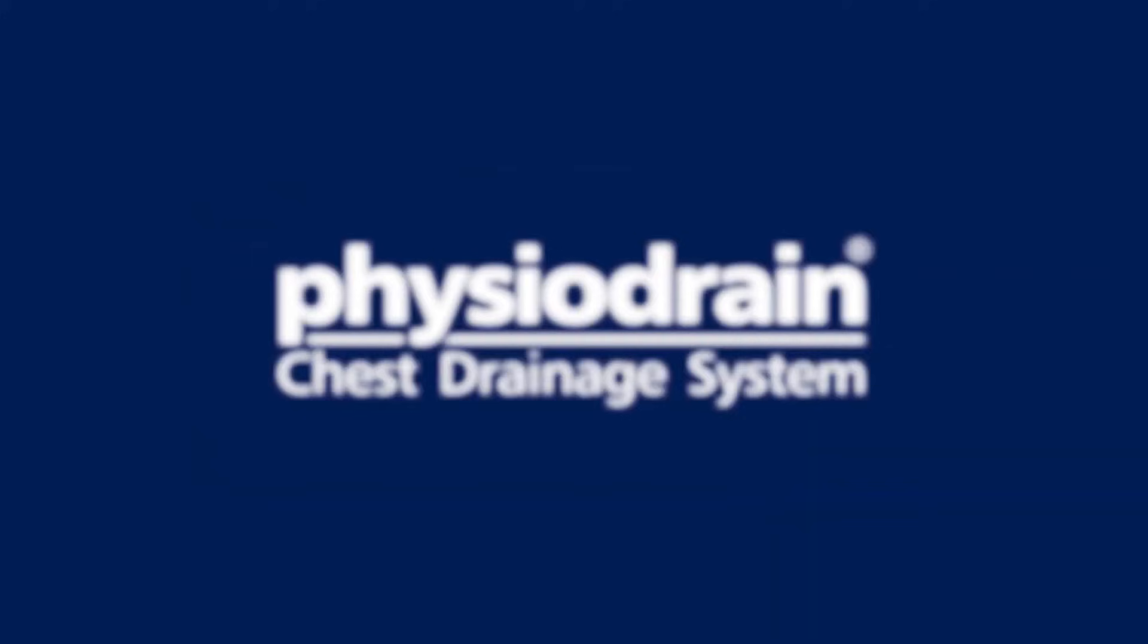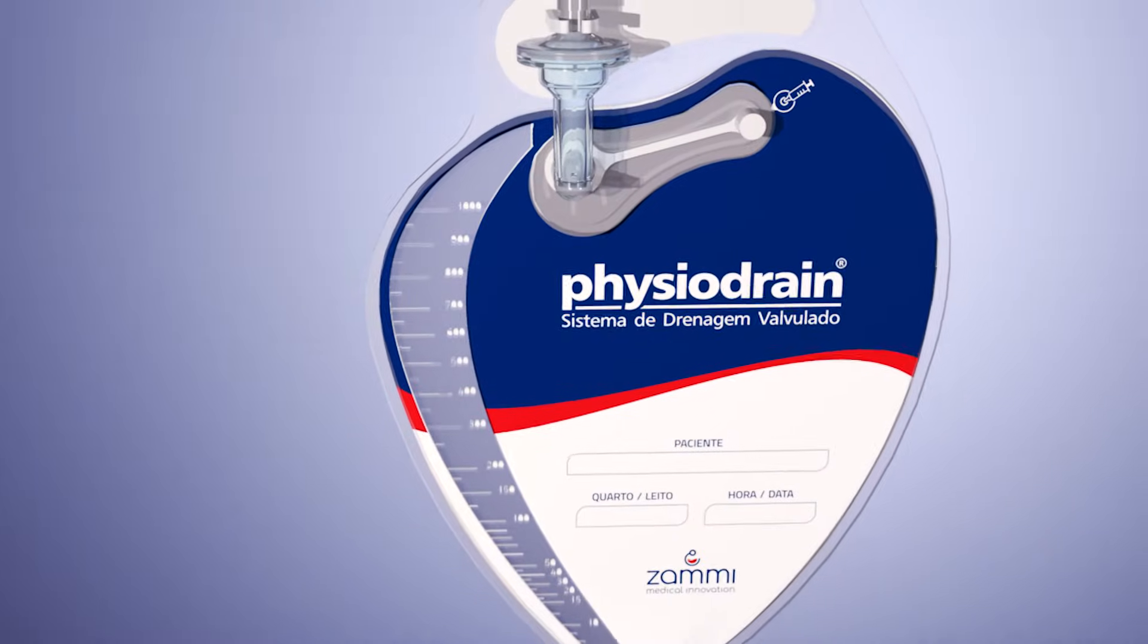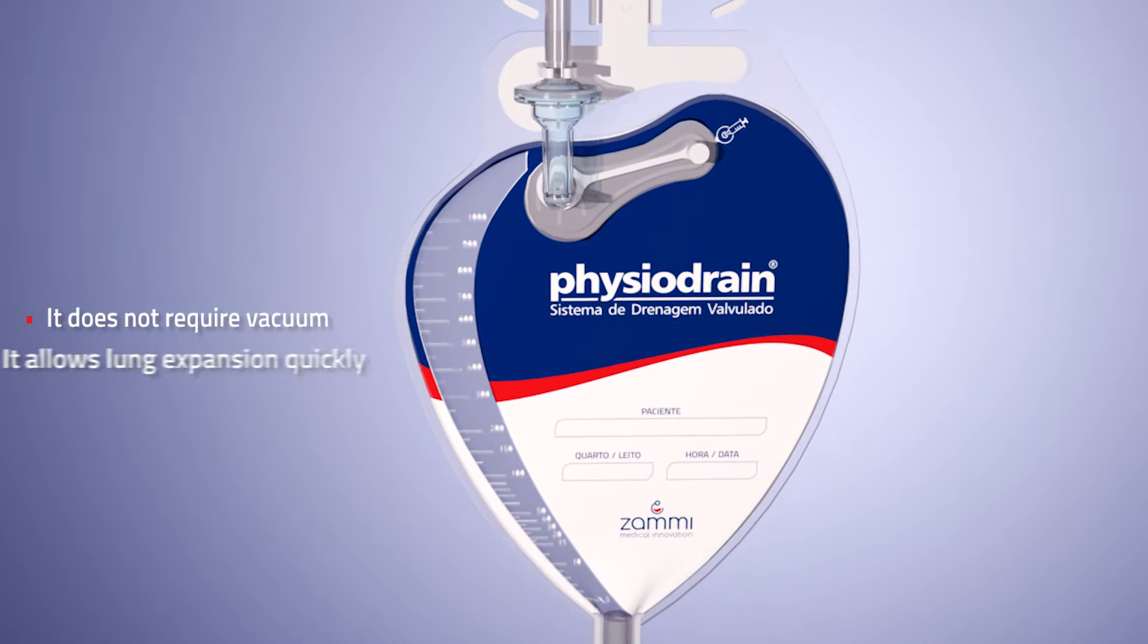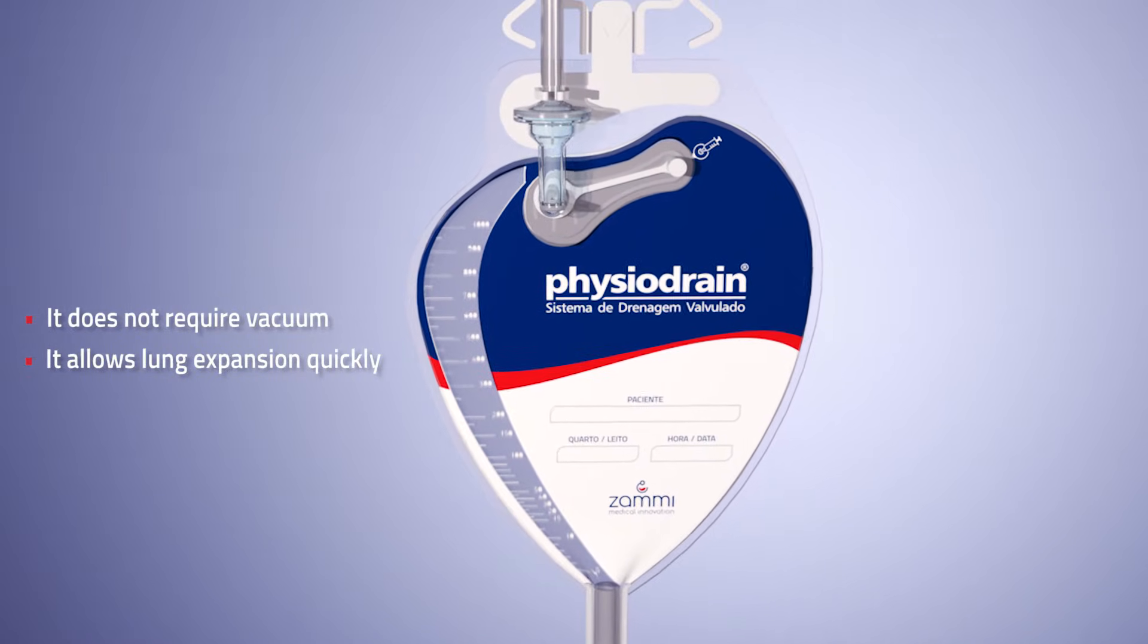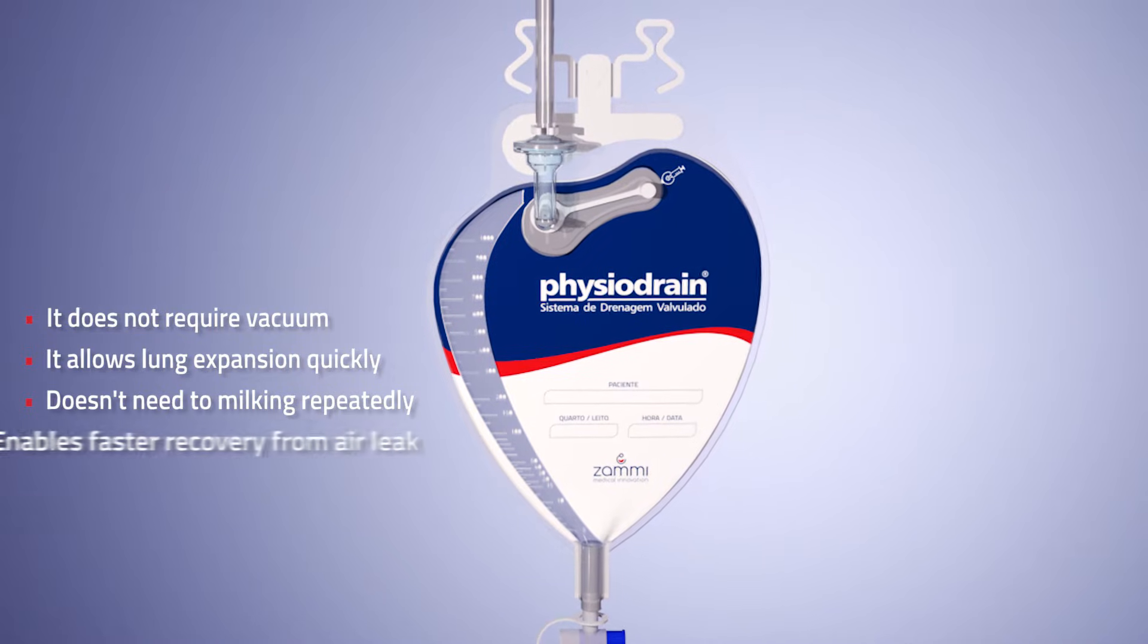The purpose of this video is to explain the working principle of physiodrain and why it has the following characteristics: it does not require vacuum, it allows the lung to expand quickly, doesn't need to be milked repeatedly, and enables faster recovery from air leak.